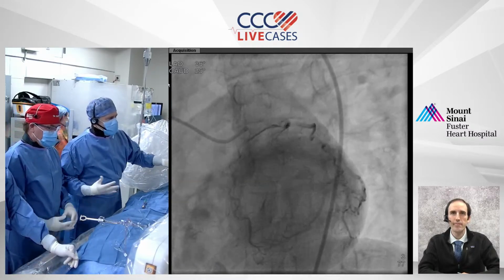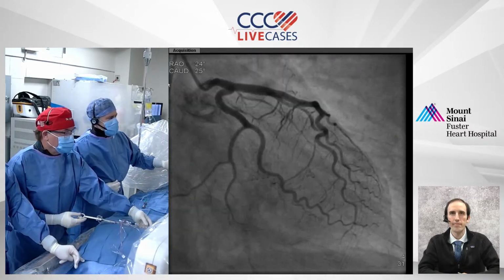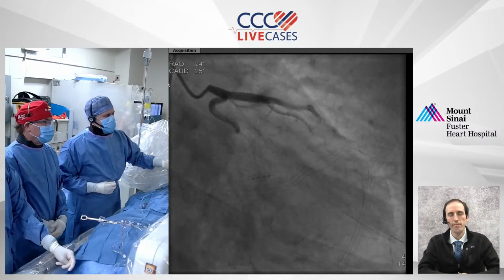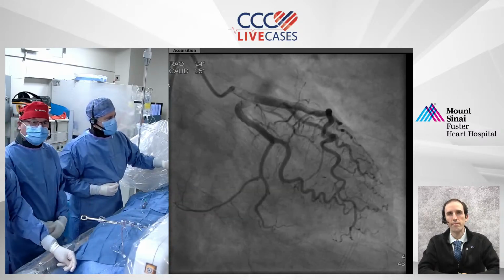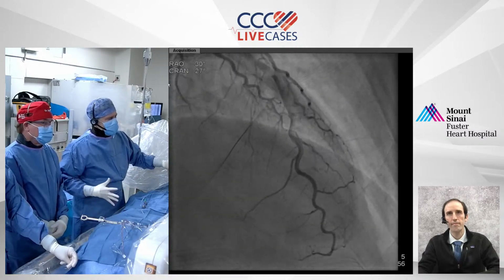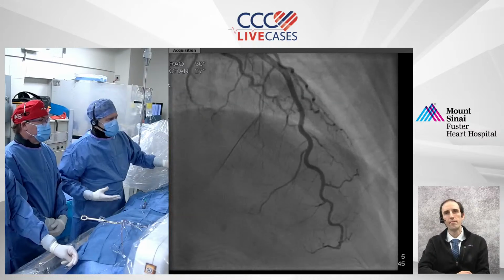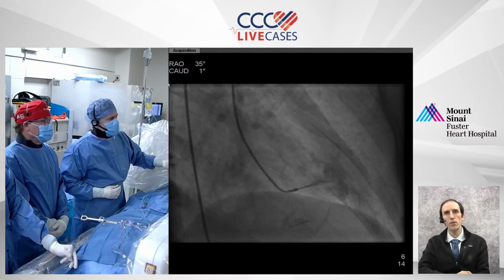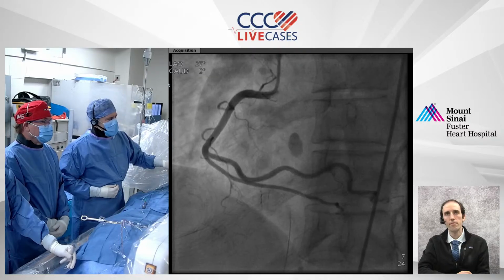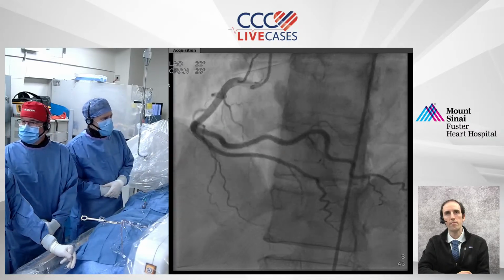And you see right up front, this looks like a pretty normal angiogram, taking our different views, cranial caudal. One thing, she's got some fairly tortuous vessels, which is interesting, and how that may come into play with what we find. Her LAD is a beautifully straight vessel with the distal vessel being tortuous, but a large caliber vessel, and no clear obstructive coronary disease angiographically. Yeah, beautiful angiogram. Her LV function is completely normal. And she has a right dominant RCA, which is completely normal as well and clean.